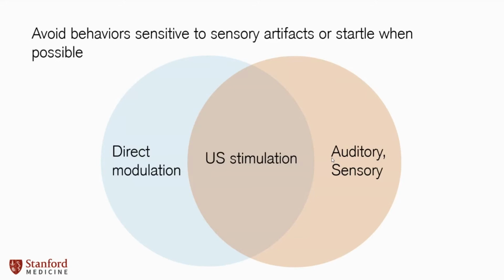And a big red flag advisory here. So I actually will credit this idea to Mikhail Shapiro, who we talked about this in a lecture recently that I was a part of. Ultrasound has mechanical effects. There's no doubt about it. It's really, really difficult to mask them. I would argue that you can never fully mask them. So if you've ever held an ultrasound transducer to your head or to your hand, even if you don't hear it, you can feel it. So there's this sensory component that is outside of audition.